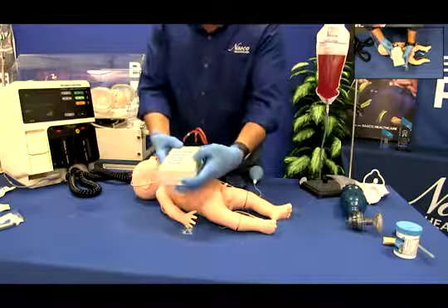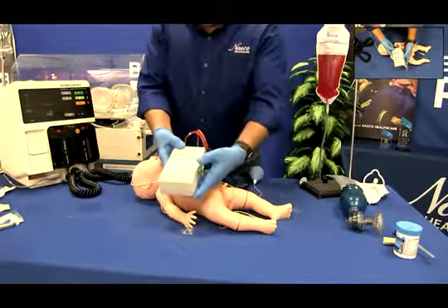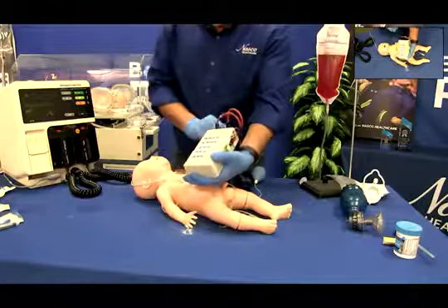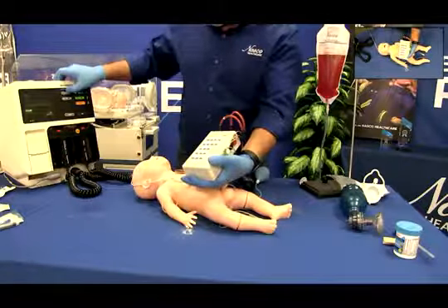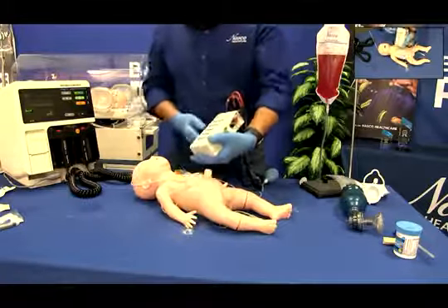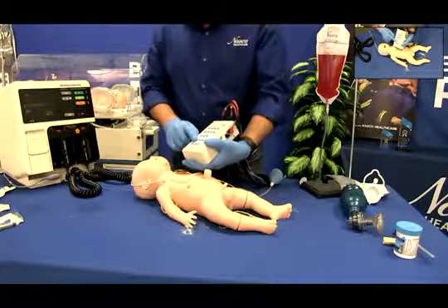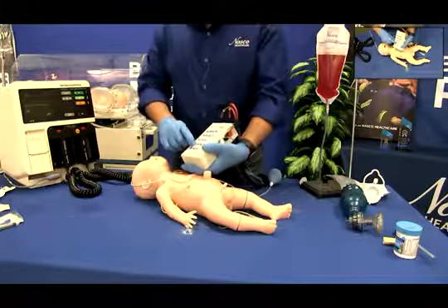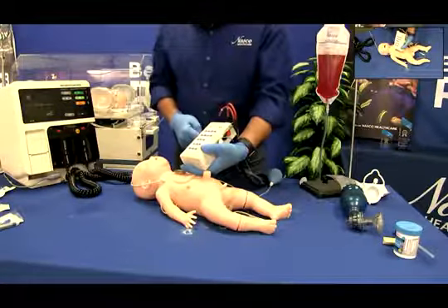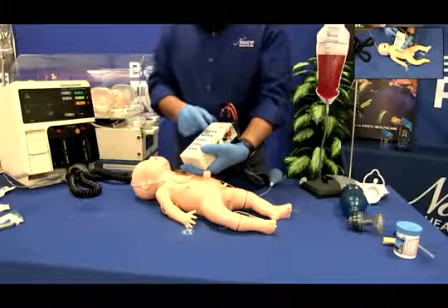Next, press any of the rhythm buttons to select the rhythm for the scenario you are running. The rhythm will be displayed on your AED monitor. To convert, select the initial rhythm to display and then press the convert button. Select the rhythm to display after conversion. This rhythm will be blinking.